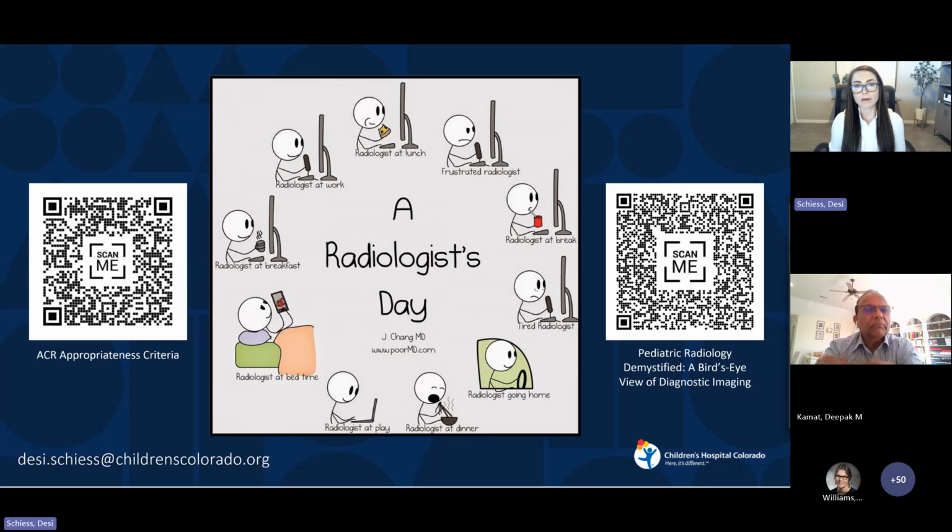The other thing that we have, for all patients, is an innovation in CT that's come out in the last handful of years called dual energy CT. Some of our CT scanners are now sophisticated enough that they can generate a virtual non-contrast image. That can be helpful in certain cases.